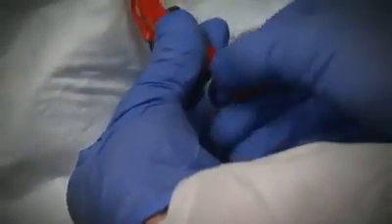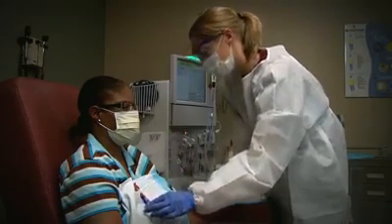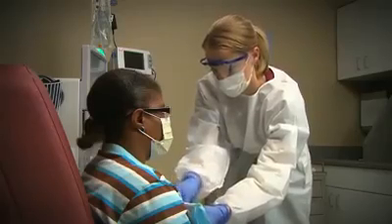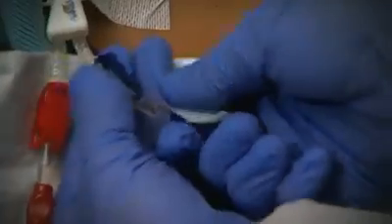The second approach requires an extra step. You scrub the luer lock hub of the catheter located under the cap with antiseptic agent before you connect the catheter hubs to the dialysis machine's lines and tubing. Vigorously rub alcohol wipes across the hubs for proper cleansing and to thoroughly remove any visible blood or clots. You must do this properly to prevent bacteria from getting into the patient's bloodstream and circulating through the body. If you don't perform this step properly, you're putting the patient at risk of septicemia or bacteremia, which are the major bloodstream infections that occur all too frequently in dialysis patients with catheters.